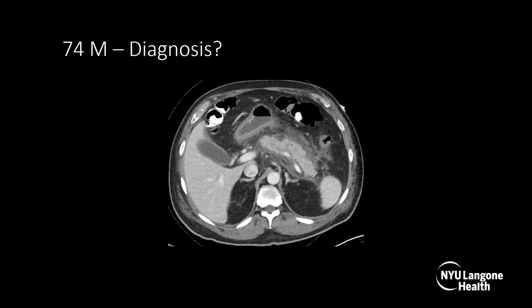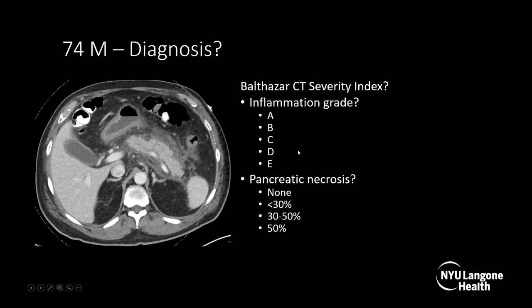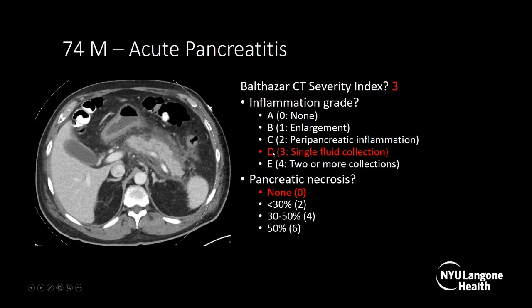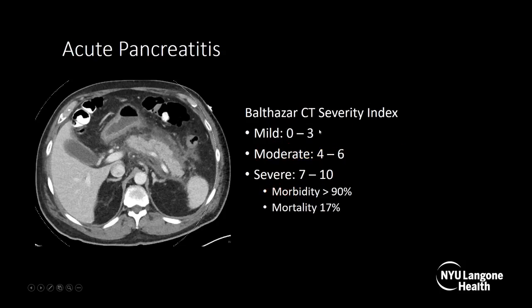This is a 74-year-old male. On this axial abdominal pelvic CT with IV and positive oral contrast, you can see around the pancreas there's peripancreatic fat stranding, but also there's a fluid collection. The portion of the pancreas shown enhances completely. So the Balthasar CT severity index would be grade D — one fluid collection and no necrosis — giving a score of 3, which is mild acute pancreatitis. Severe acute pancreatitis is associated with morbidity over 90% and a mortality of 17%.